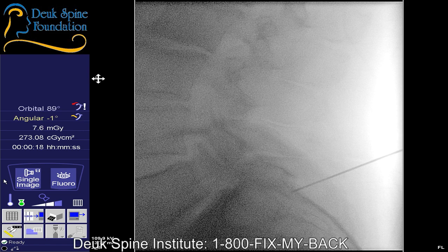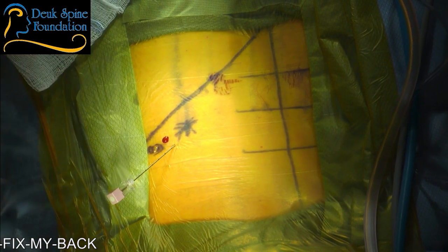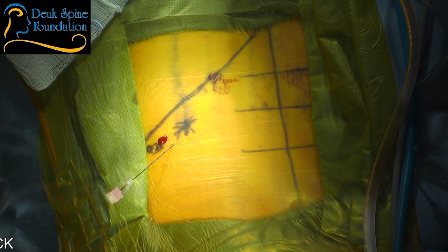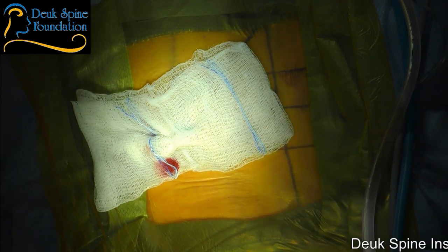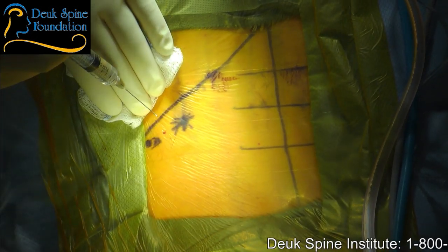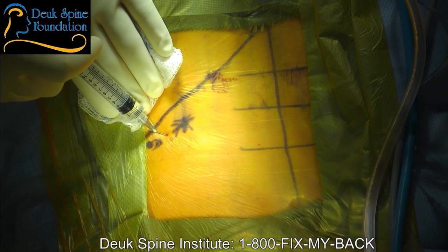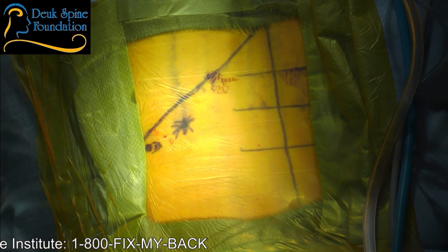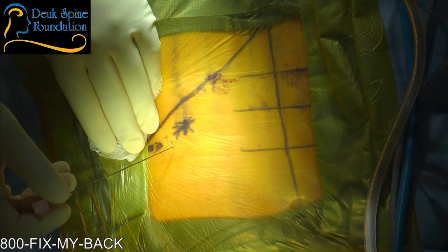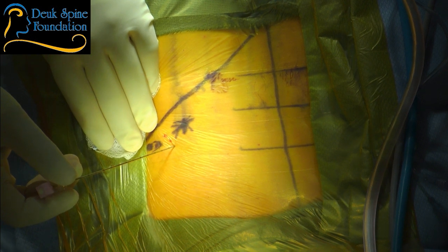All right. Well, so L5-S1 should be, I'm not going to say anything to jinx myself, but it should be reasonably shot. Interesting. This, the plane, I'm going to have to go more north. Some more local? Yeah, yeah, the angle of the disc space, exactly. Luis, I like it. Starting to understand, develop countermeasures. All right. Now, I mean, could it really be that high? Yeah.